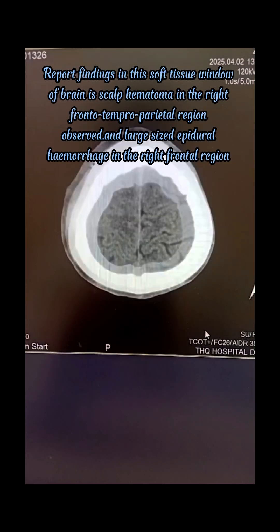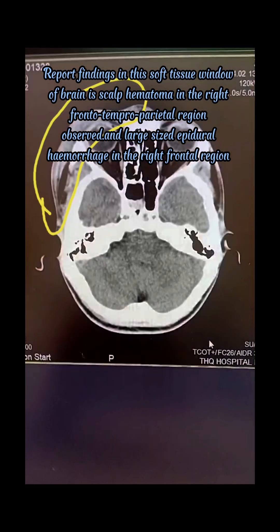Report findings in this soft tissue window: scalp hematoma in the right frontotemporal parietal region.